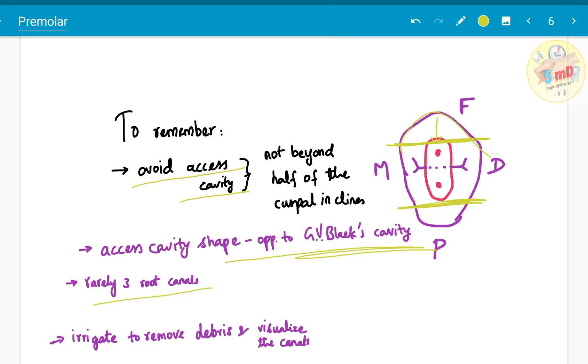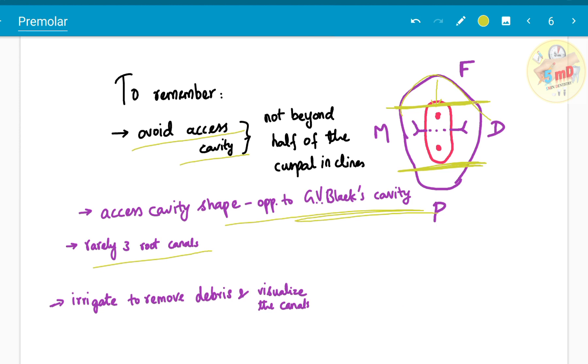Rarely three root canals can be present, so make sure to look out for that also. And irrigate and remove the debris to facilitate the easy location of the pulp canals chambers orifices. These are the takeaway points to remember.